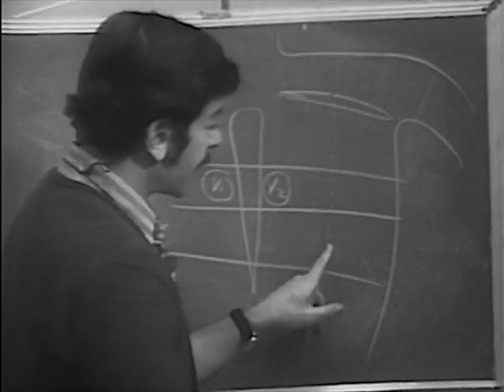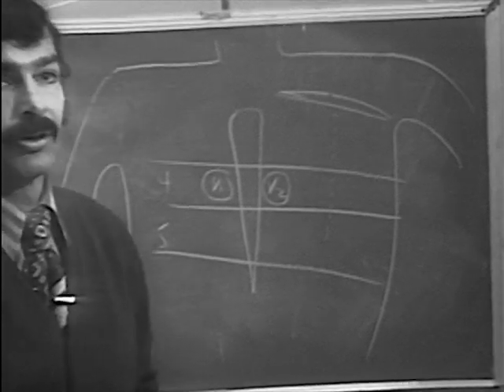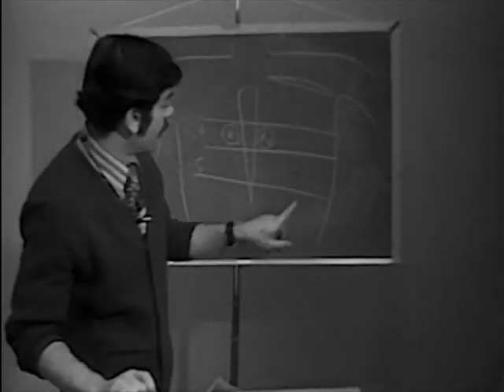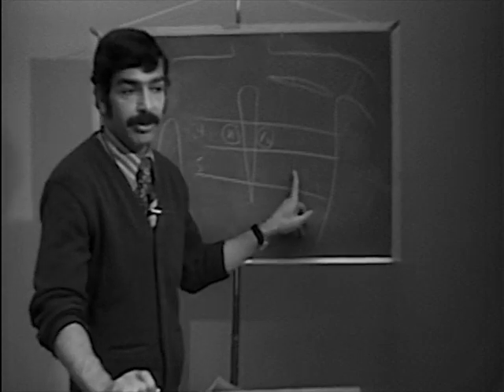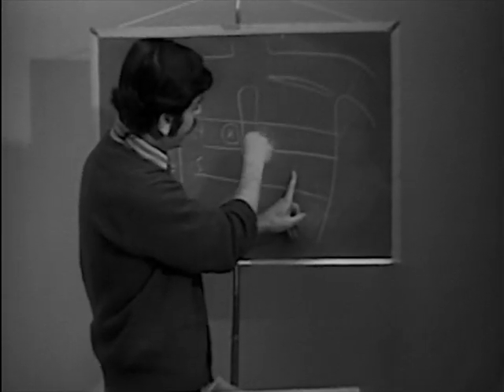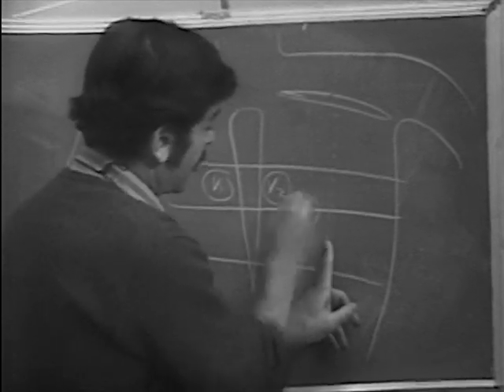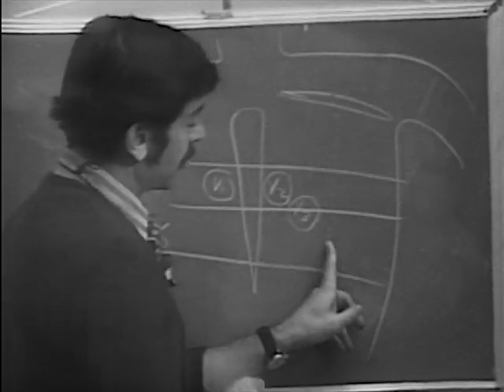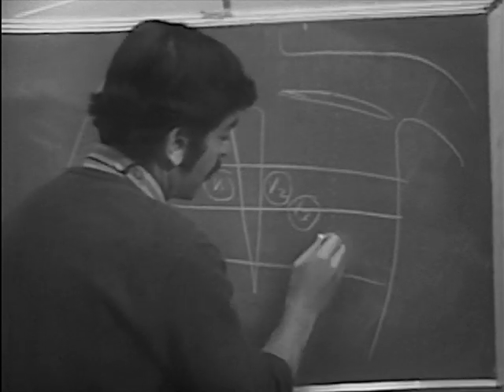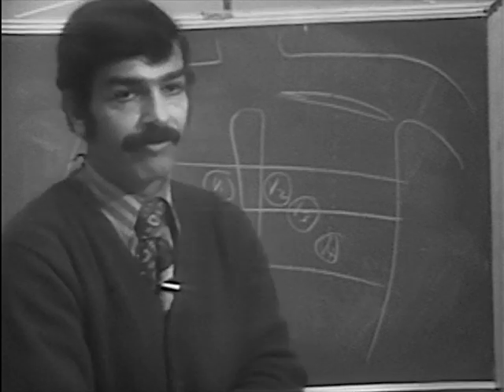But we don't take V4 before we take V3 because we'll confuse the technician or whoever has to mount this. So we put our finger on the spot where we think V4 ought to be, and then there's the red suction cup mark from V2, and then right in between there should be V3. Then V4, as I indicated. Now where do we put V5?